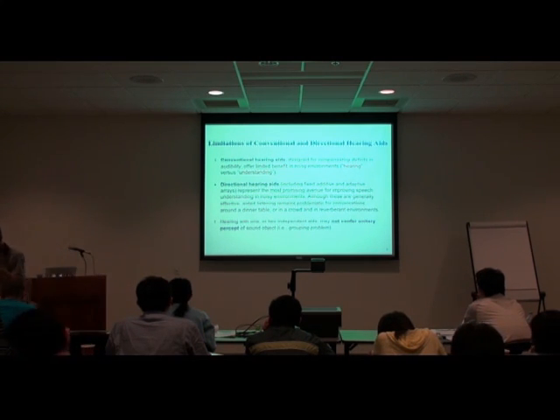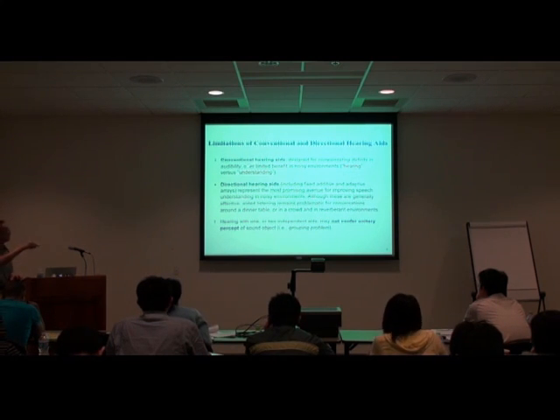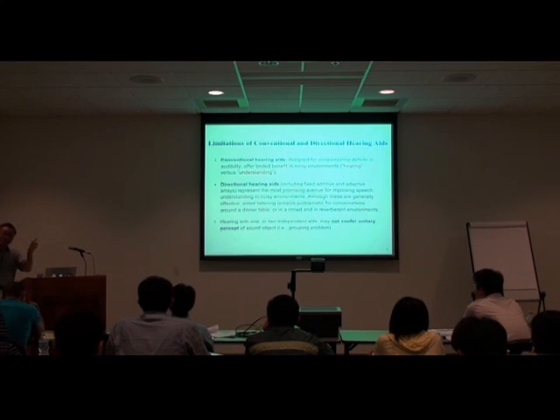The problem was first exposed to me as a severe problem. The acceptance rate of hearing aids is very low because people always complain, "I don't understand what I hear." So this is a very different kind of problem.